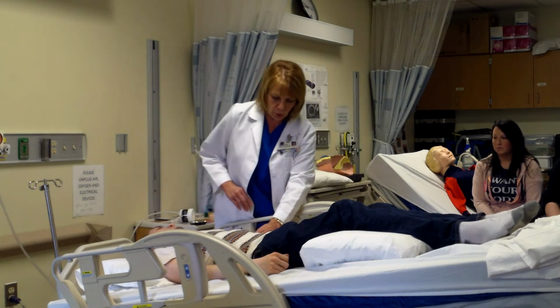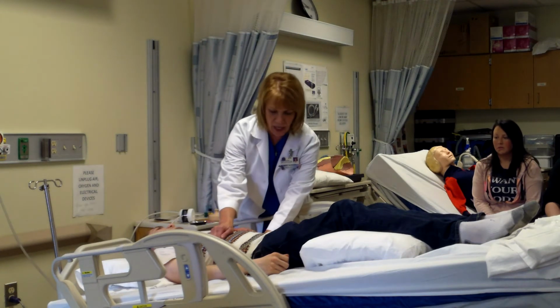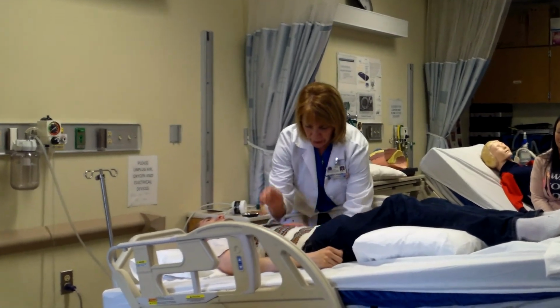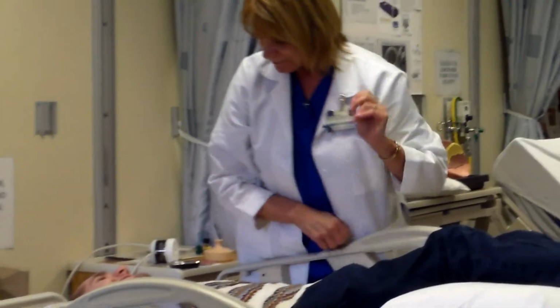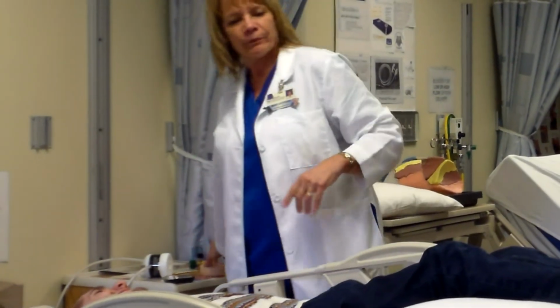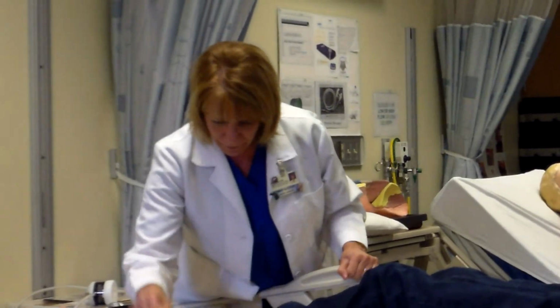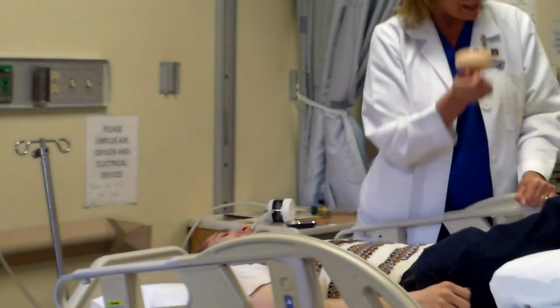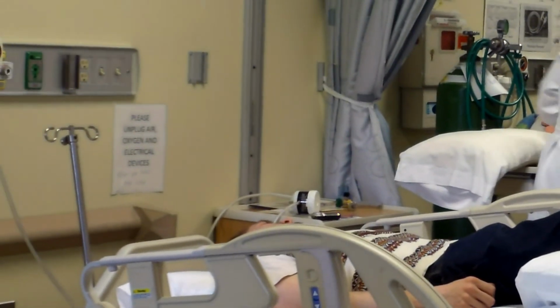So I'm going to find the lower edge of his ribs, okay, and I'm going to place one hand on each side. Ready? You got to do that for 5 minutes. Or you can use the little percussion cup. That works, and they come in a whole assortment of sizes, from little preemies to big adults, okay?